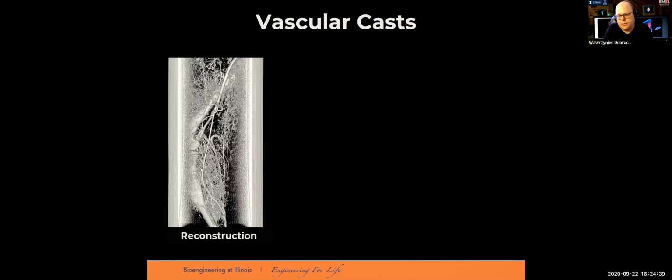Similarly, with the same technique and the same methodology, we did the vascular cast of the mouse legs. On the left side, you have the reconstructed image from the specimen scanner. Again, this was the leg of the mouse. Maybe you can recognize the bone structures here and some vessels combined together. It was placed in a tube just to avoid any movement during the 4-hour scanning. But really, for me, it was nothing which I would consider a good quality image.